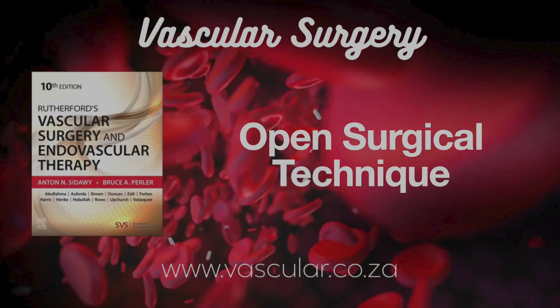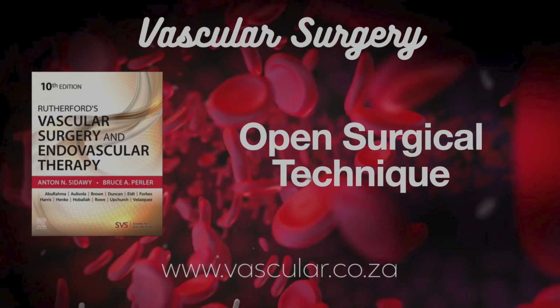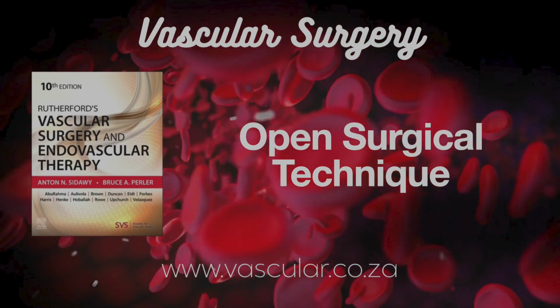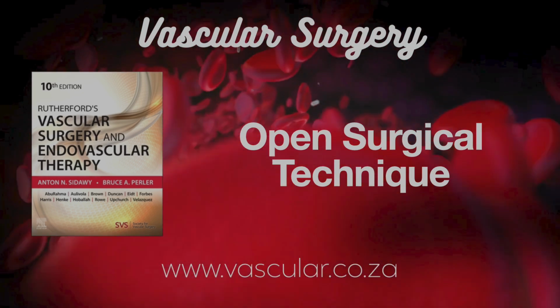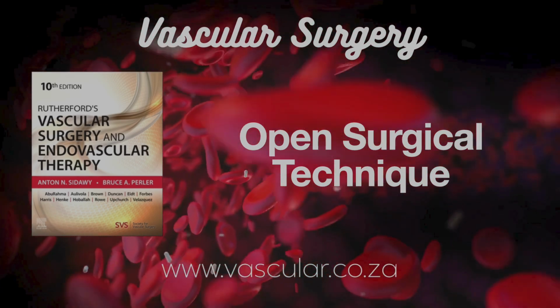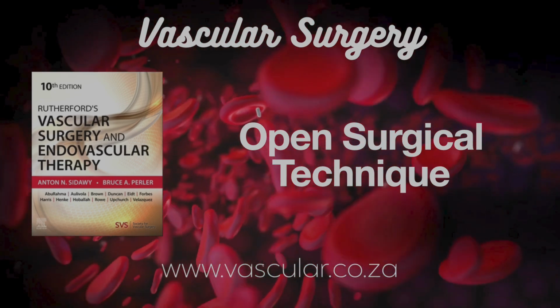Okay. Now, the moment of truth: stopping the blood flow. Vessel control. Clamps seem like the obvious choice. They often are. Ideally, you place clamps on a disease-free segment of artery. But what if it's all diseased? Then you try to find the least diseased spot. Feeling the artery against a right-angle clamp can help locate plaque, often on the back wall. If there's a significant plaque where you want to clamp, you might need to dissect higher up to find a better spot, like going from the common femoral up to the external iliac artery.